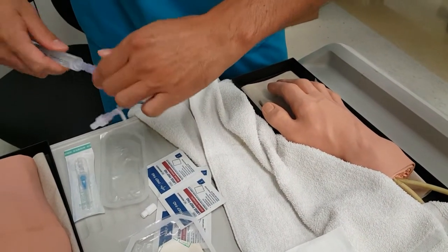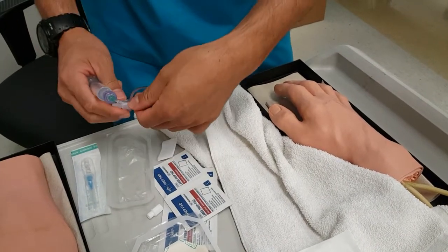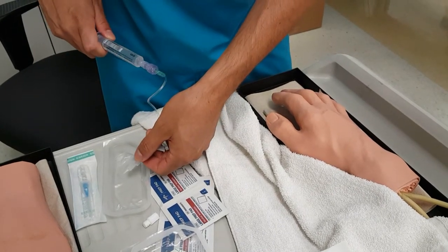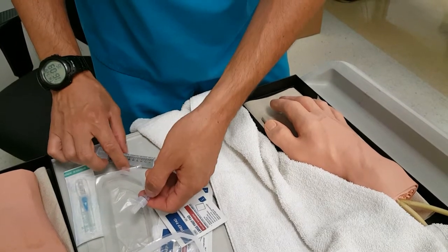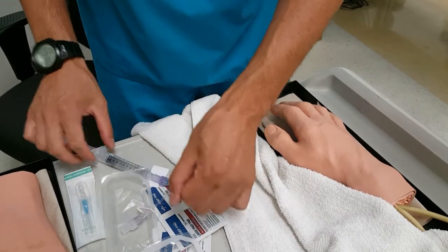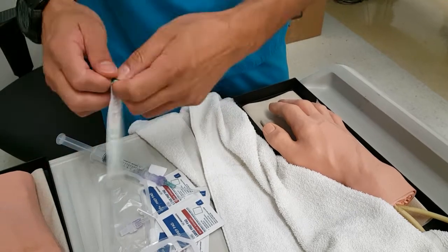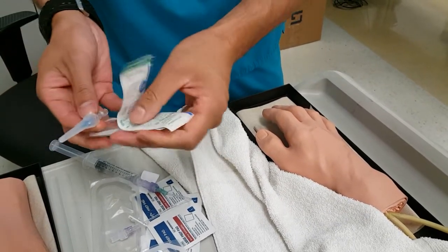Then I will prime this. Loosen this up, knowing that once I get my IV in I'm going to be one-handed — so when I get to that point I'm just going to pop it off. I unscrew it so it just needs to be popped off. Check my IVs right here.